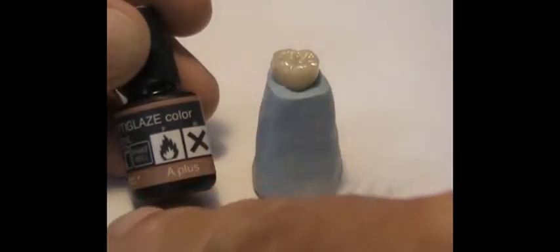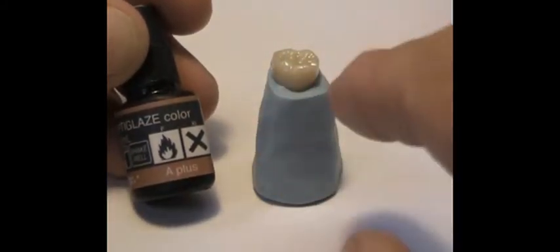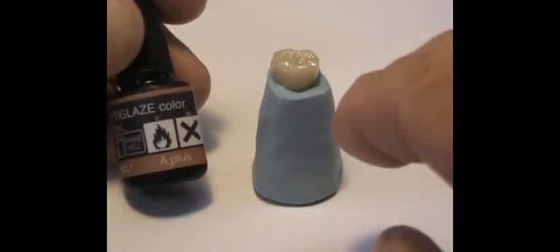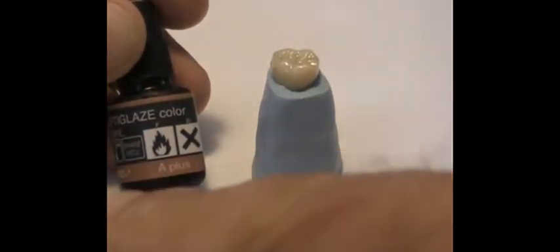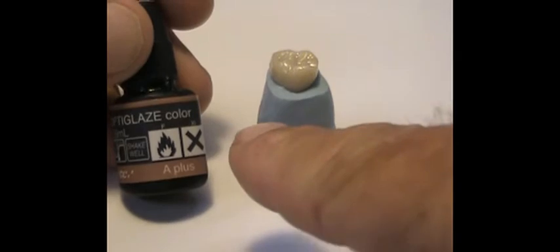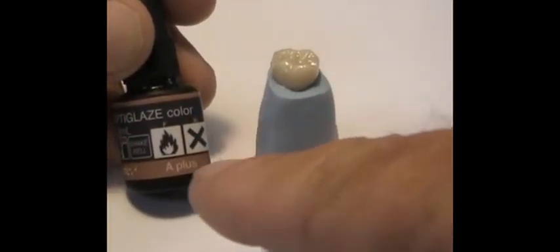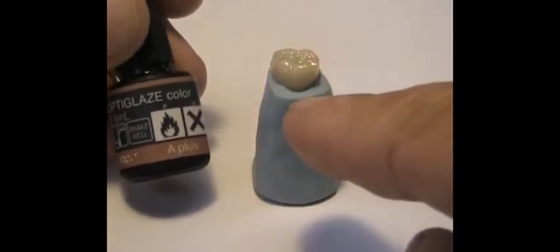It's just as easy as putting one coating at a time onto the unit, then exposing it to the halogen light and checking the shade. If we want to darken it further, we put another coating of A+ until we attain the shade we're looking for.